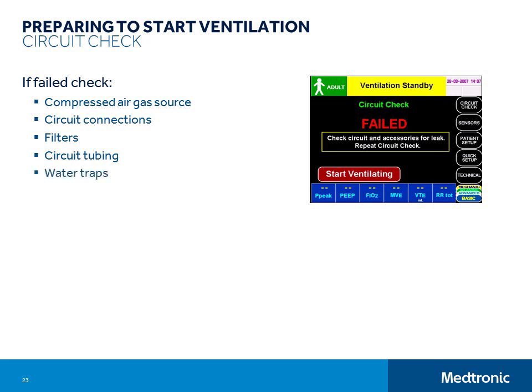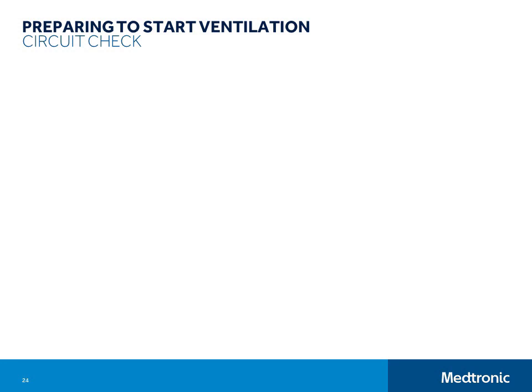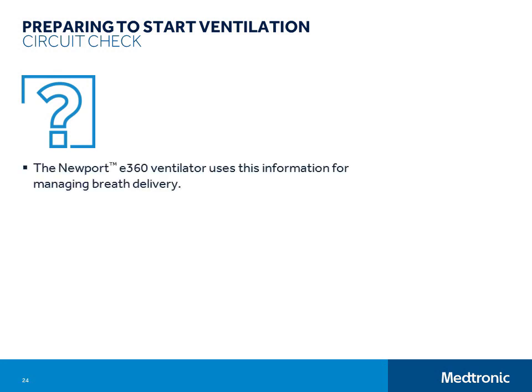If you have checked that there are no leaks in the breathing circuit and humidifier systems and the circuit check still fails, then remove the exhalation valve assembly and check for holes in the diaphragm. The start ventilating button is visible on all of these screens, so if necessary you can start ventilating from any point in the ventilator setup process. Some people are tempted to skip the circuit check, even though the E360 circuit check is very short and easy to do. The ventilator gathers important information and performs important calibrations during the circuit check. The information is used to manage breath delivery and the calibrations ensure accurate measurements and servo controlling. The circuit check has a direct impact on volume monitoring accuracy, pressure monitoring accuracy, pressure management accuracy, and the ability to compensate for compressible volume in the breathing circuit.